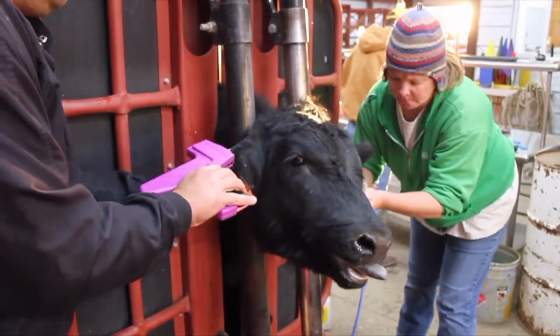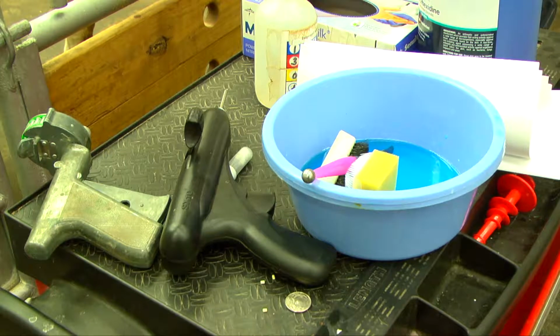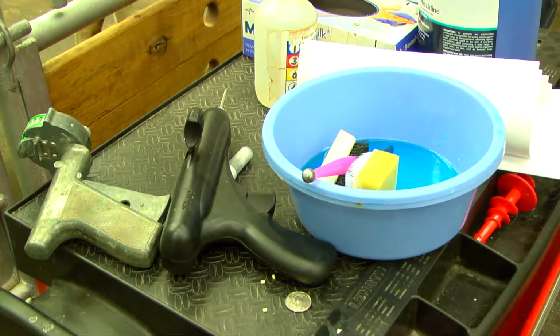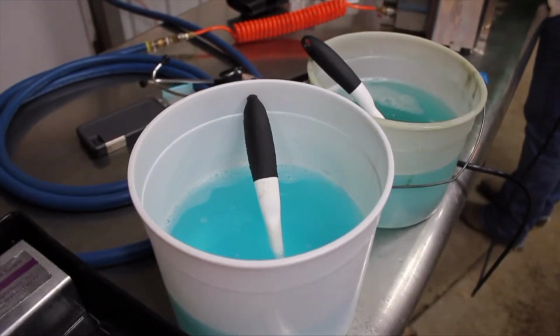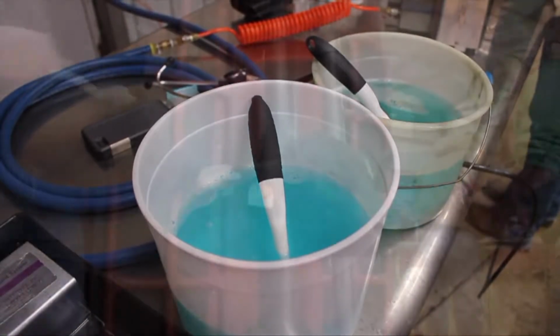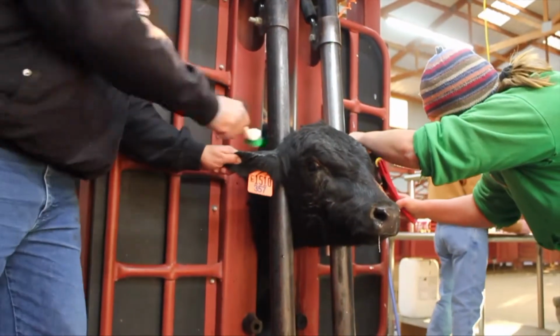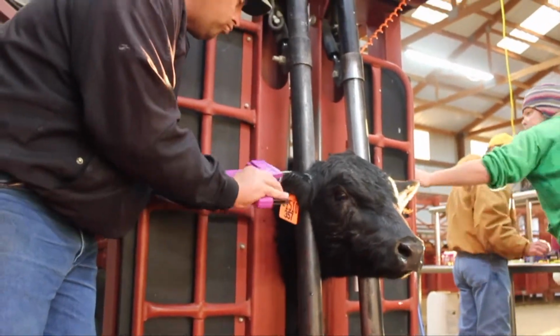If dried or wet manure is present on your brush, we may want to scrape some of that off with the butter knife. We soak that brush with disinfectant and scrape from the top of the head down. We want to pull everything down and away from the hair, because that's the way the hair grows. So we scrape that away, and after we've cleaned it and disinfected it, now we can do the actual implant injection.